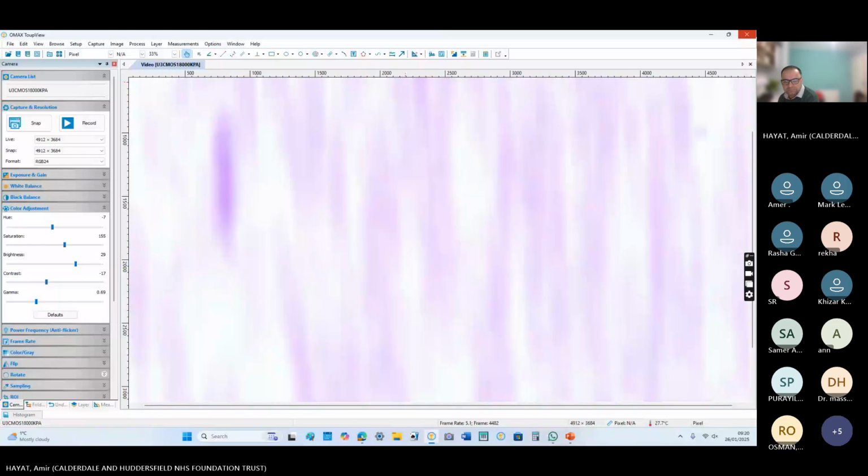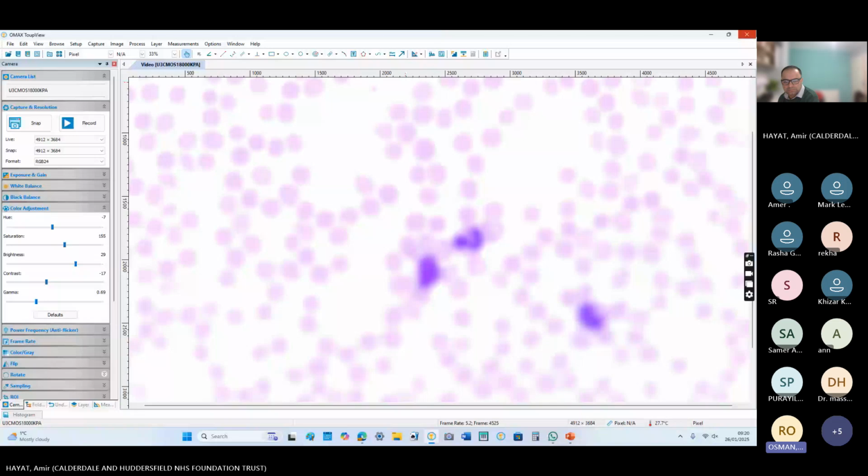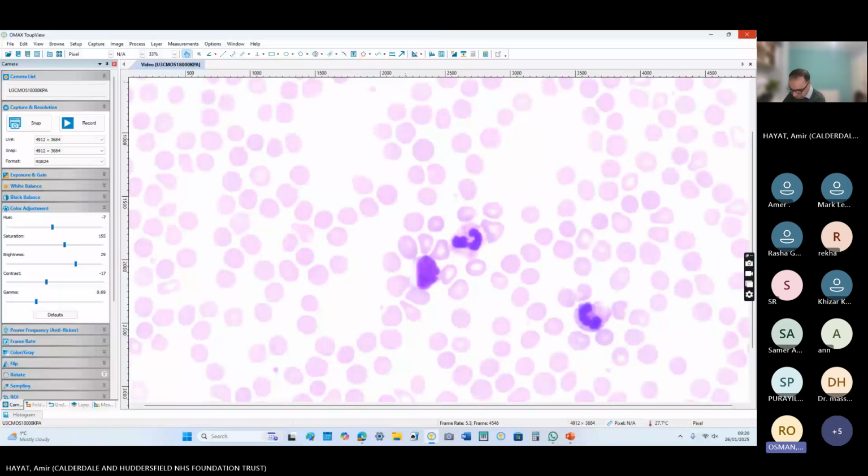What else did we say? And for chronic neutrophilic leukemia, there is no specific feature. There will just be lots of neutrophils of normal morphology. So CML, platelet count, sorry? Oh, the platelet count looks a bit low. Yes. I think that these are normal platelets, not low. He has enough platelets, almost 8 platelets in this field, power 50. It looks more like a toxic picture. Cytoplasmic vacuolation, toxic granulation. The reds look okay though.